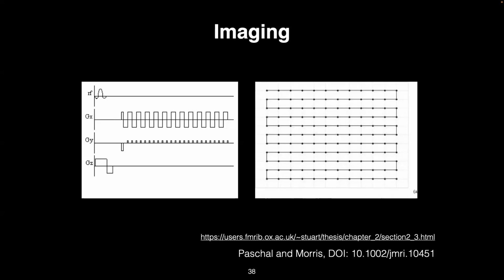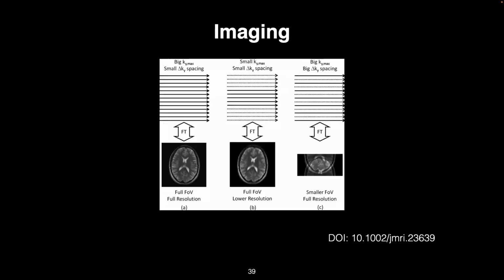So remember, from our basic echoplanar imaging, if you want to collect all the data for an image, you essentially go through and collect every single line of k-space that you need to make up that image. However, you have full control over what your scanner does, your experiments. And you can actually collect less data than you would need to collect for a full resolution experiment.